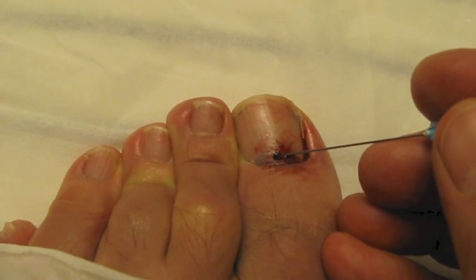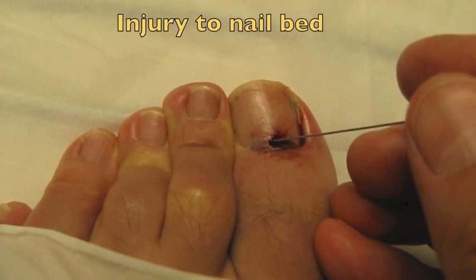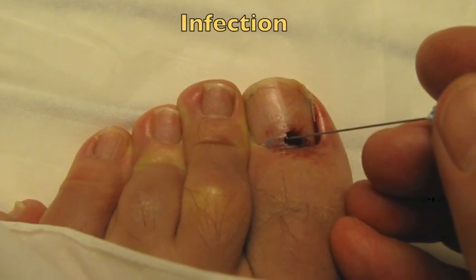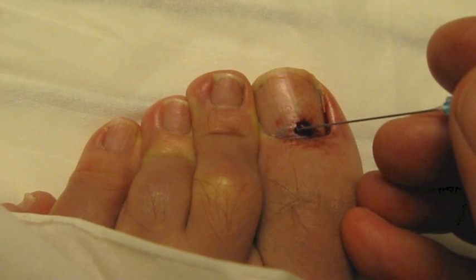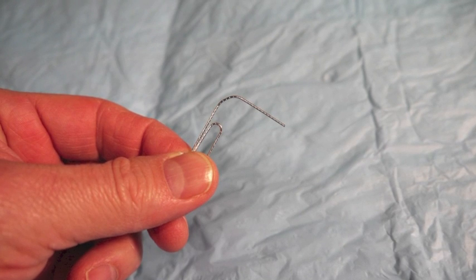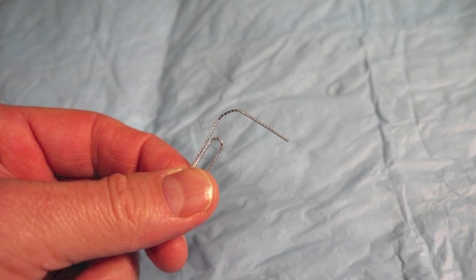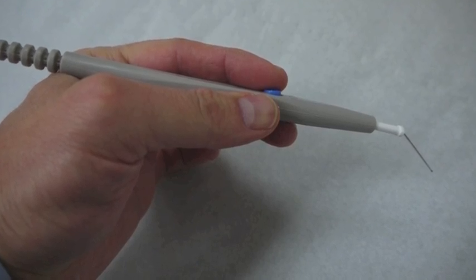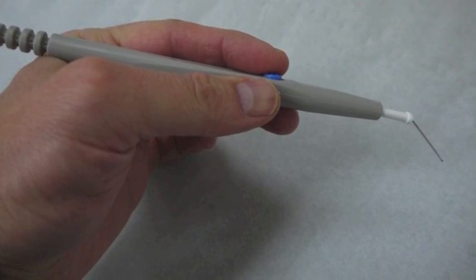No complications are expected, but if the tool is advanced too deeply, the nail bed can be injured and deformity to the nail can be induced. There is the possibility of infection and also of ineffective drainage if the hole is not large enough. The procedure is contraindicated if there is a need to explore the nail bed for lacerations, if pain is absent, or when electrocautery is used on acrylic nails, as they are flammable.